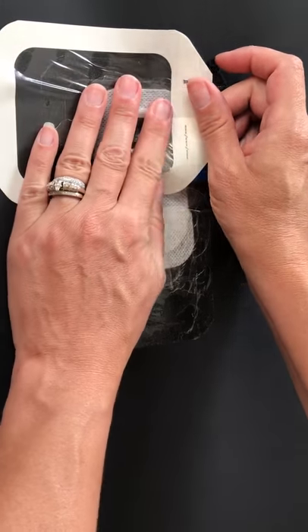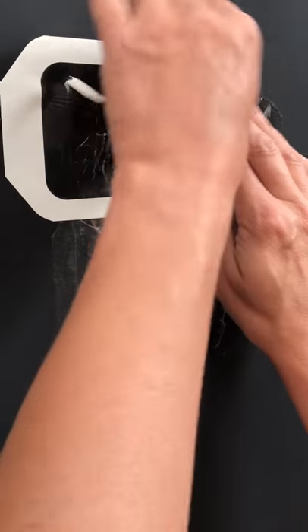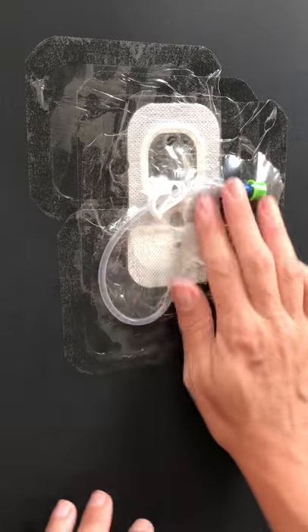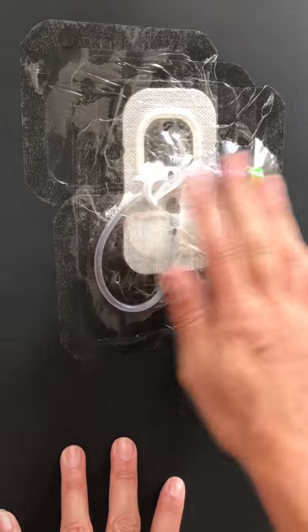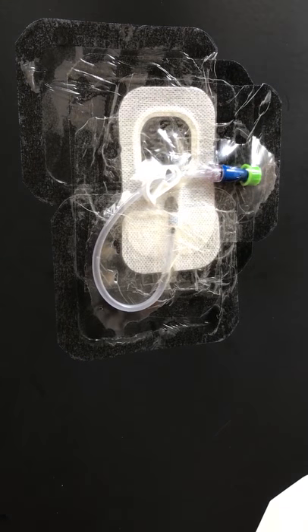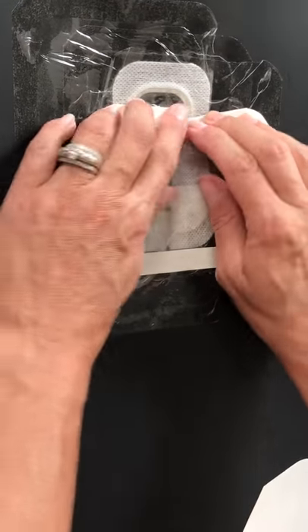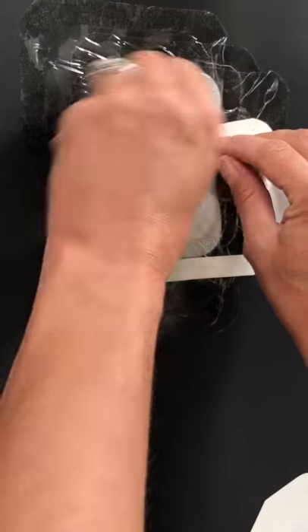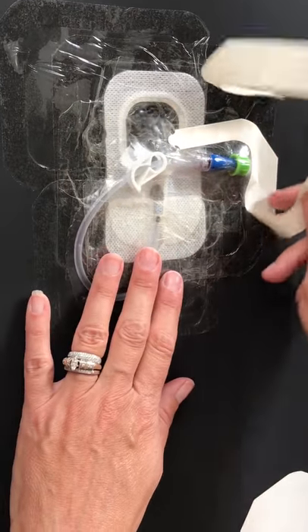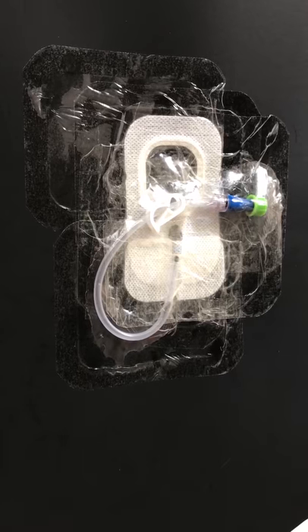Obviously, I'm not using as much as I normally would if I was doing this for him to go swimming, so this just gives you an idea of what I was doing. For where the clamp is at and the Kuro cap, that's where I would put a bunch of layers and just keep on going so that way nothing would puncture through. As they are in the pool swimming — no lakes, no rivers, no streams, and no salt water pools. They say chlorine pools only.